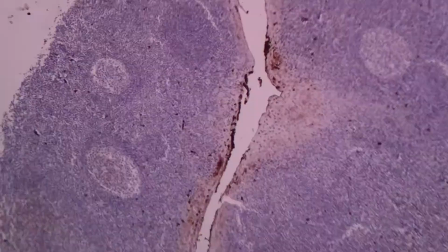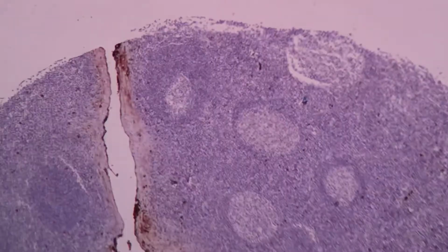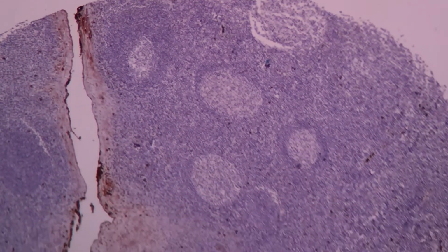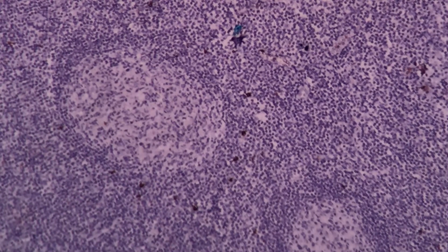Now if you see the germinal centers, there is hardly any staining evident at this power. We just try to look at them more closely.